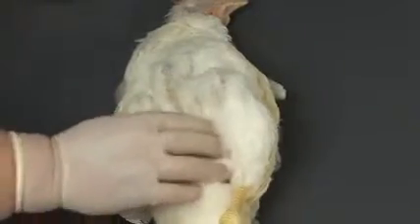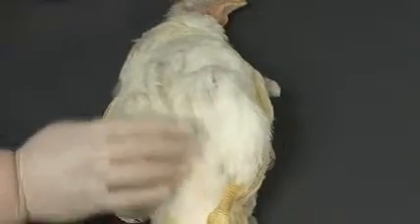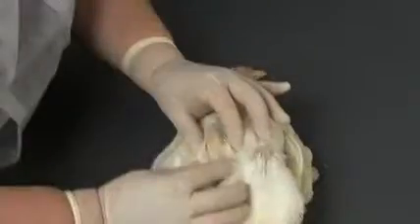Assess the body condition of the bird by determining the amount of fat stored at the thoracic inlet and over the keel bone and pectoral muscles. Fat can be visually recognized as soft yellow deposits beneath the skin. However, body condition is best assessed by both visualizing and palpating the fat and muscle over the breast.